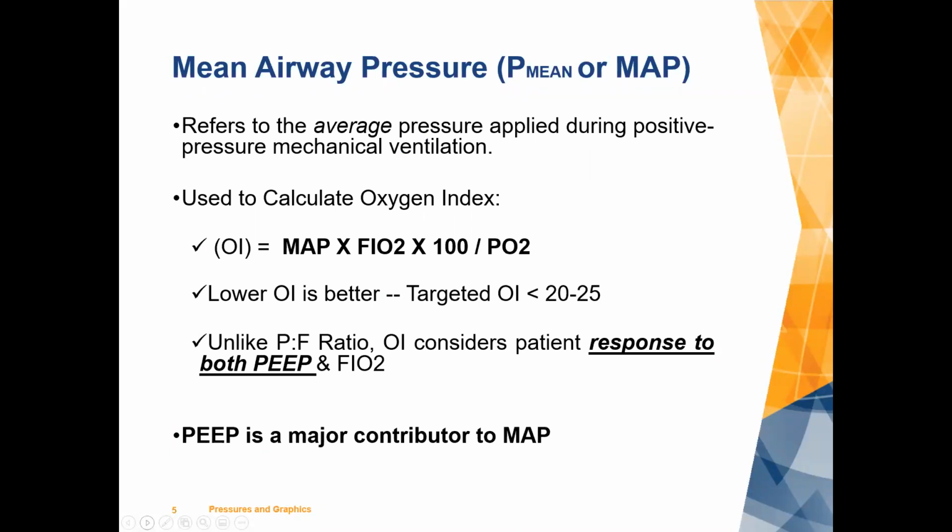So that's peak airway pressure. It's not insignificant. We certainly can get twitchy when peak airway pressures start to approach and exceed 40 centimeters in adults. But again, what we now know is it's less commonly implicated in what we call ventilator-induced lung injury than some of the other measurements that we have.